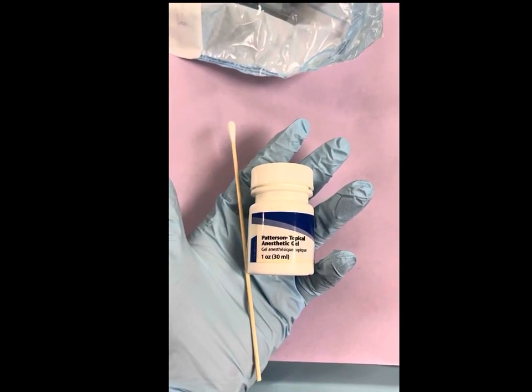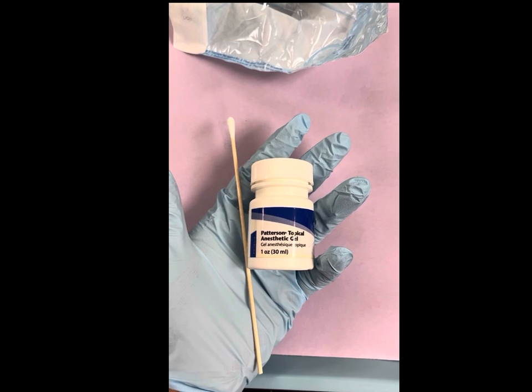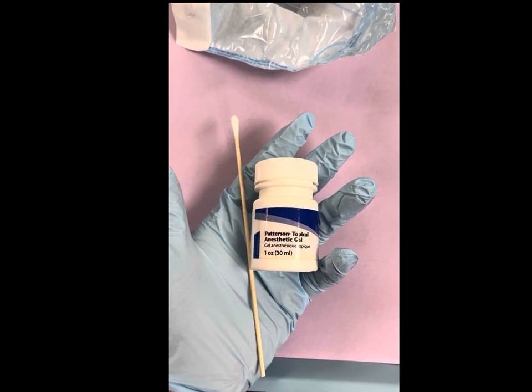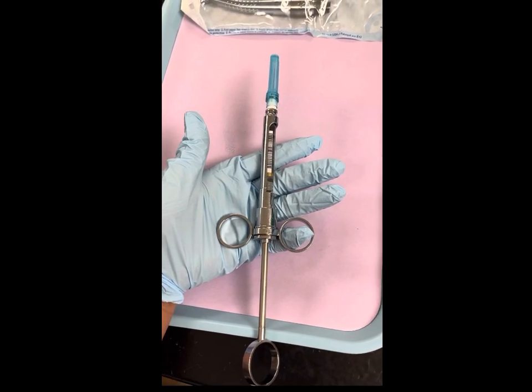This will be the topical anesthetic. It's going to help numb an area of the mouth to be able to inject the local anesthetic. Once it's numb, you can inject the mouth with a local anesthetic.